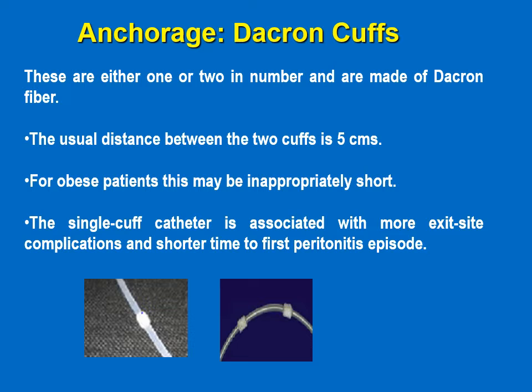And the distance between the two cuffs is usually 5 centimeters. However, it's not appropriate for obese patients. We should use more space between the two cuffs if we are using it in obese patients.